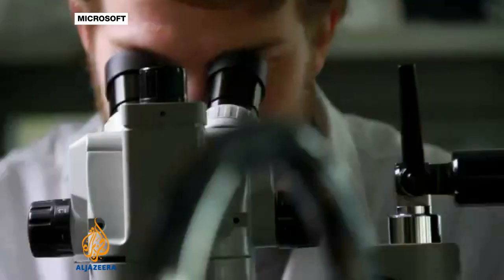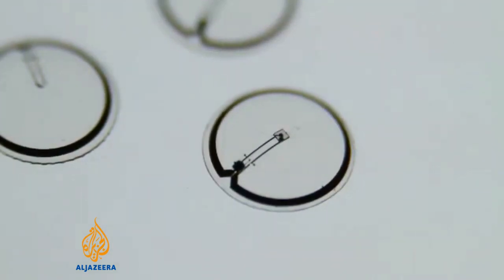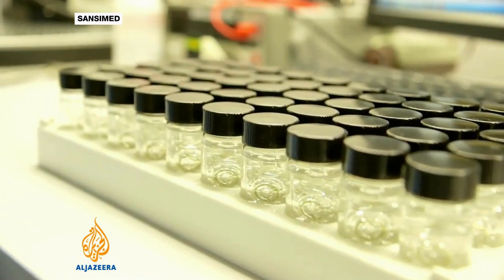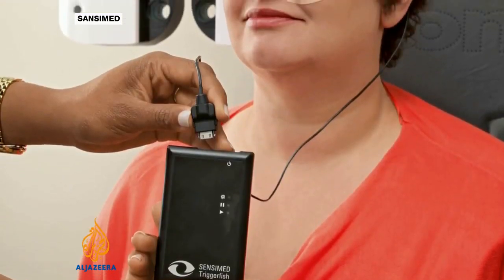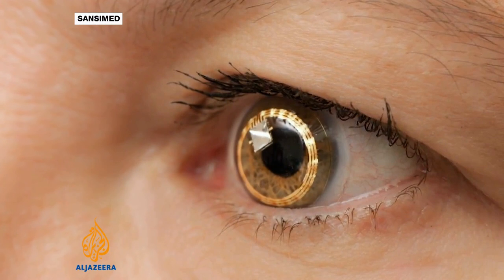It's not the first such project. Microsoft has been working on a similar lens, announced in 2011. SensiMed has developed a telemetric sensing contact lens. Another smart contact lens has been developed by a Swiss company — this one records around-the-clock data about the eye to help customise the treatment of people with glaucoma.